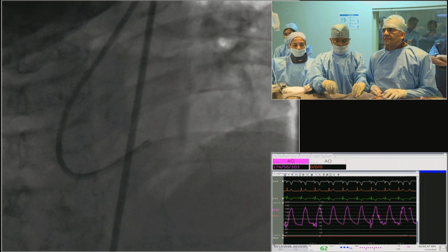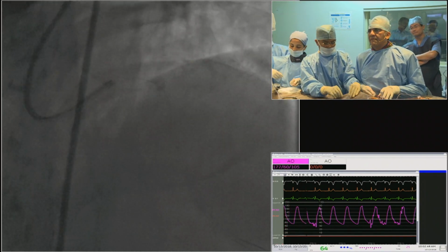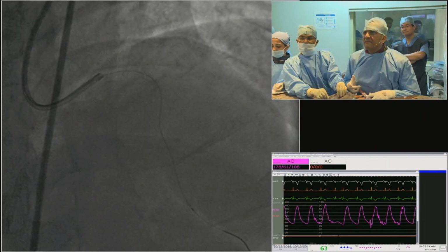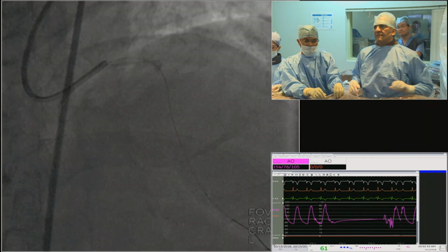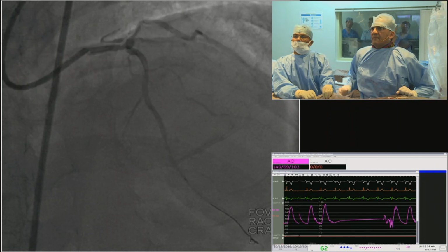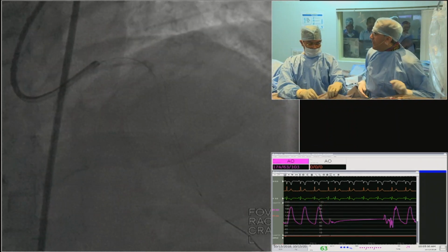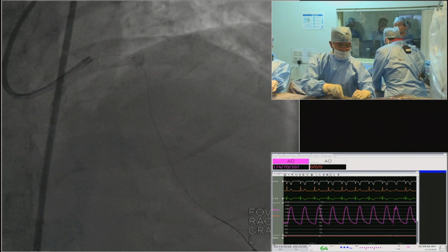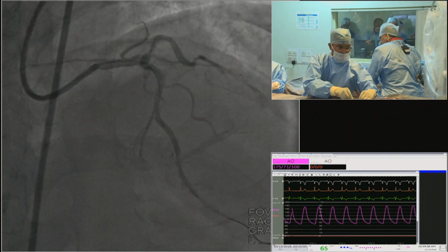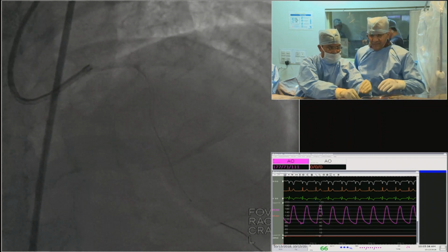Balbir, would you like to comment whether you would like to do the proximal stent first or the distal? Balbir also wants. So let's take a show of hands. How many people would like to do the distal stent first? So we have about 75% people who would like to do the distal stent first. And how many would like to do a proximal stent first? So we are a minority, but all the same, it's okay. It's better to be a minority. Well, Anil, I think it is only 3 people.